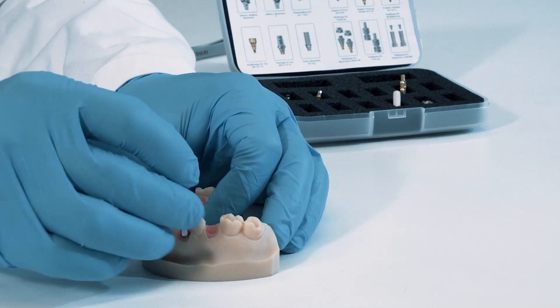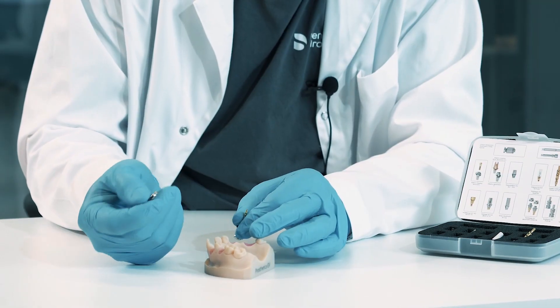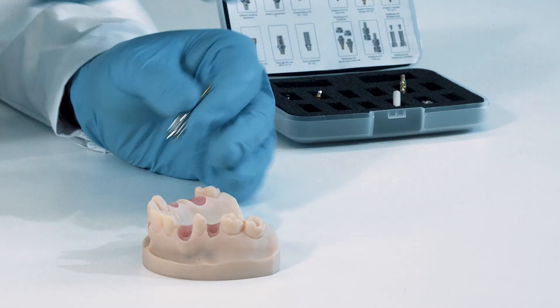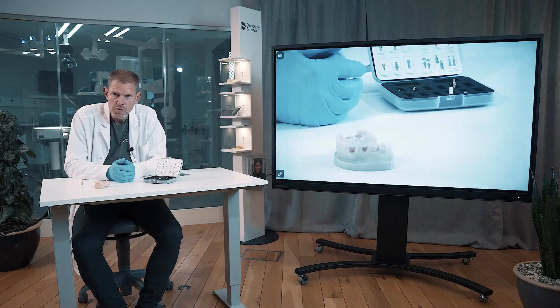I remove the abutment screw first and then take out the abutment. That was the first three of the abutments we have for the implant level, but there will be more later on.